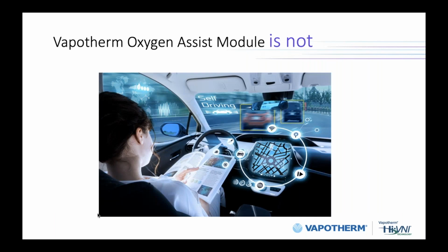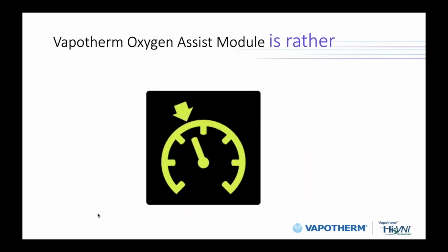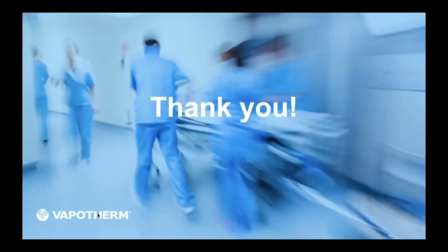So to conclude the first couple of minutes of this webinar today, please note the Oxygen Assist module is not a set and forget system. The Oxygen Assist module is not a self-driving car. I would say the Oxygen Assist module is rather a cruise control. You are in charge of your speed limit. You are in charge of choosing the right SpO2 target. The Oxygen Assist module, though, will help you to keep the babies on the desired speed that you set on the desired SpO2 target.